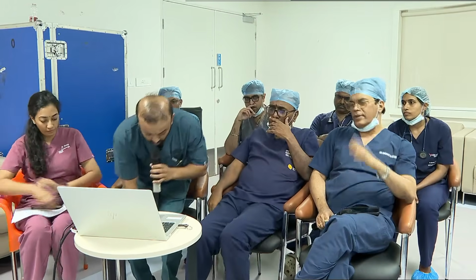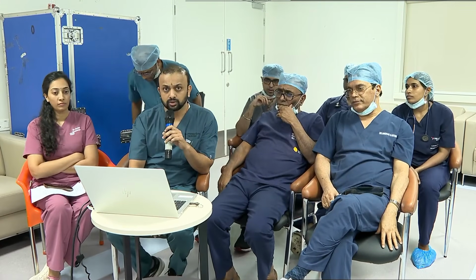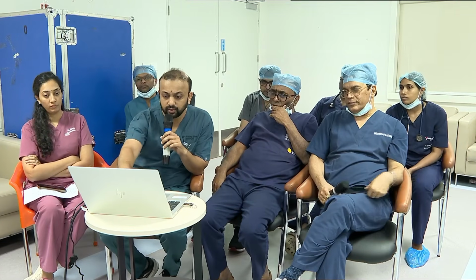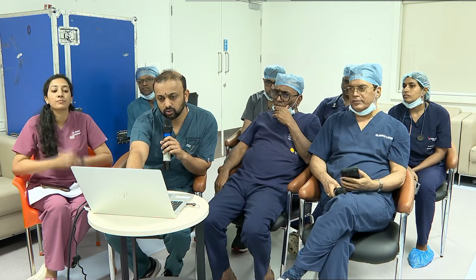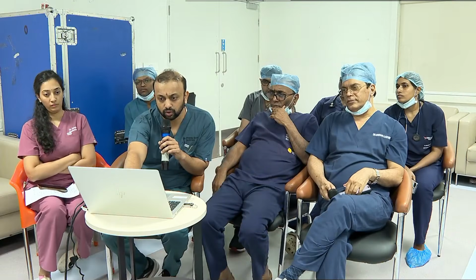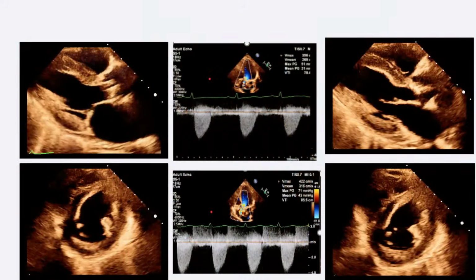So very good afternoon to all. Today we have come up with two challenging TAVR cases which we did recently, so we thought of sharing that and building the knowledge of each and every one. It's basically a case of an 83-year-old male who is a hypertensive diabetic and who has undergone a bypass surgery in 2004. He comes to us with dyspnea on exertion for the past 20 days.